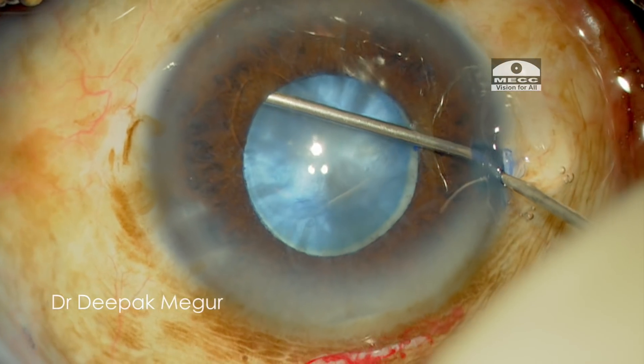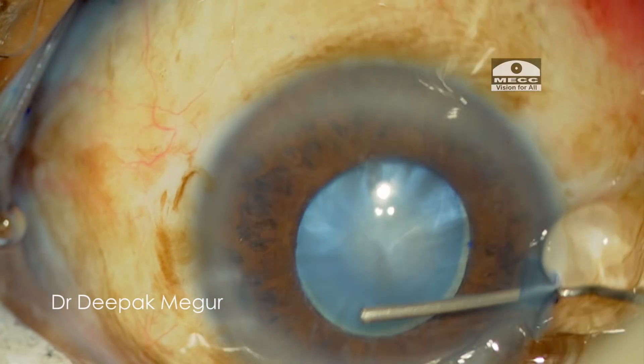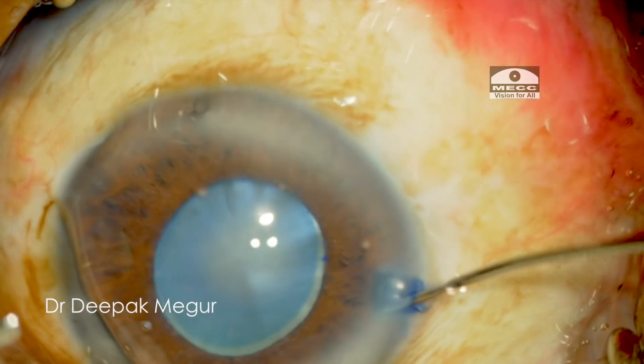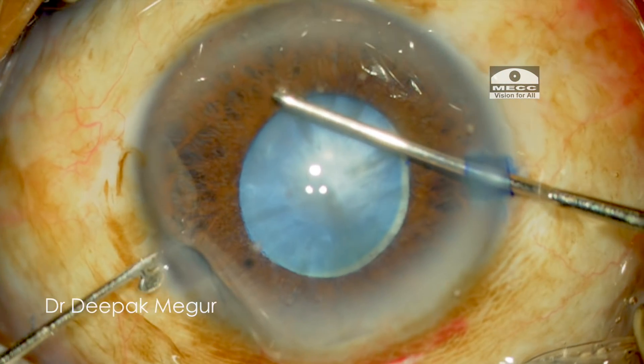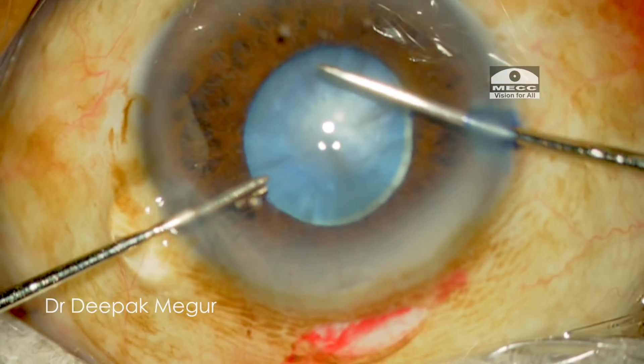First the dispersive OVD goes in, followed by cohesive OVD underneath it, and also putting the OVD a little bit behind the pupil to create some space so that the Coughlan hook, which I'm using for stretching the pupil, does not damage the anterior capsule.